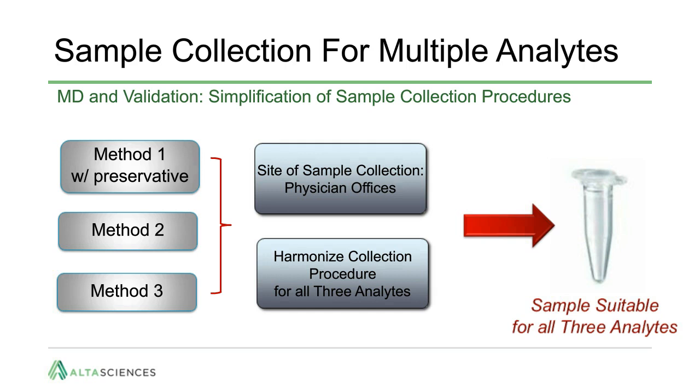Considering the workflows and technical competencies at the site of sample collection, it was decided to simplify the sample collection kits and harmonize the collection procedures. While the preservative was not scientifically necessary for all 3 analytes, simplification of the procedures at the site of collection ensured minimal collection deviations and reduced complexity for the staff manipulating the samples.